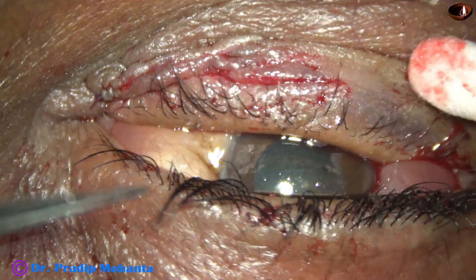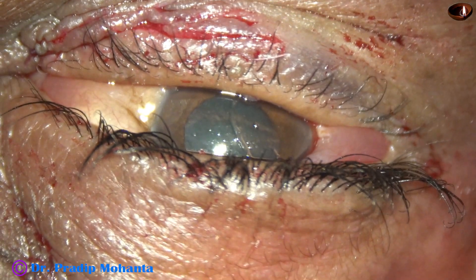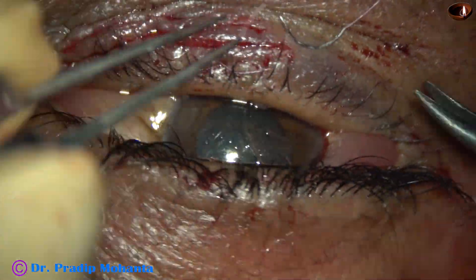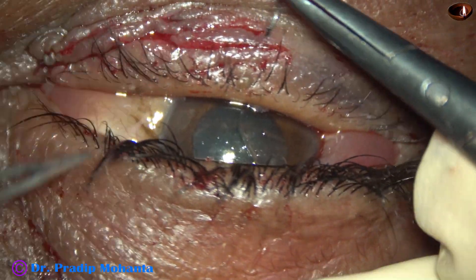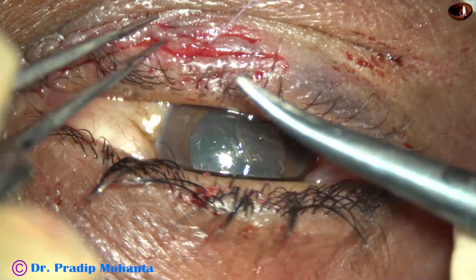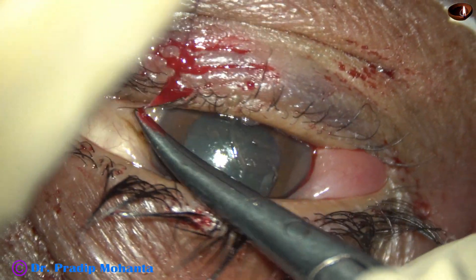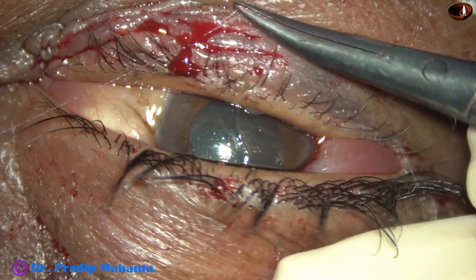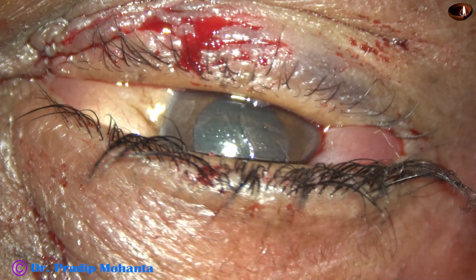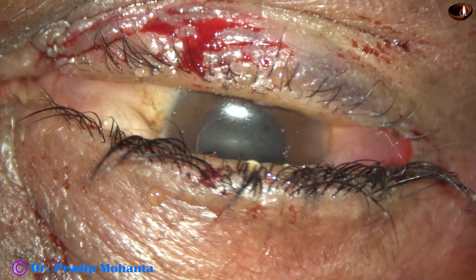And it is done. We have repaired the lacerations. The cornea is dry; we have to put some antibiotic drops on the cornea. I am putting one small bite so that the two margins are opposed in a better way. And after this, put some antibiotic drops on the cornea and close the case.